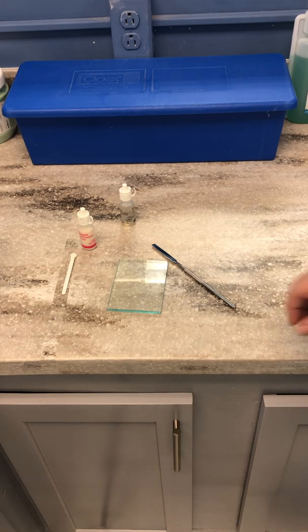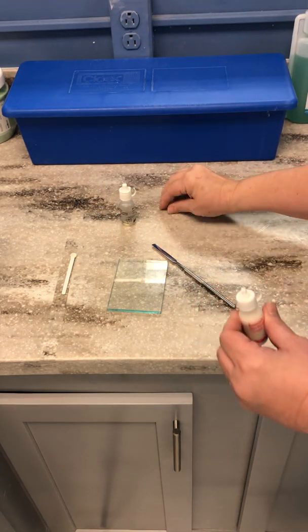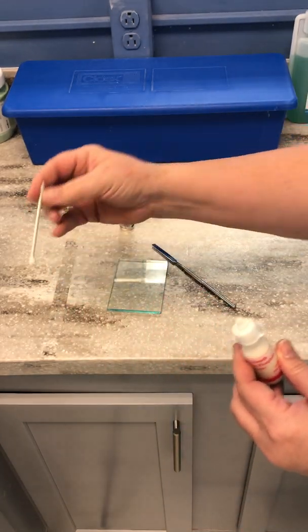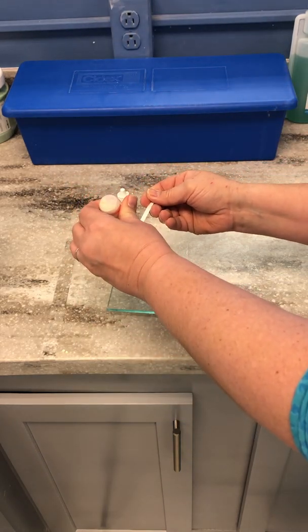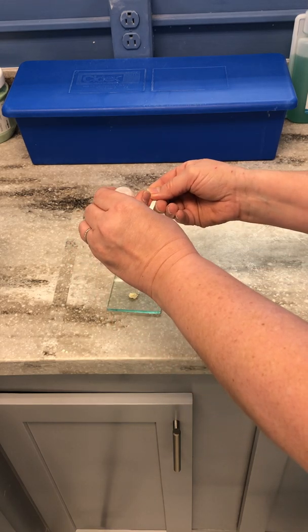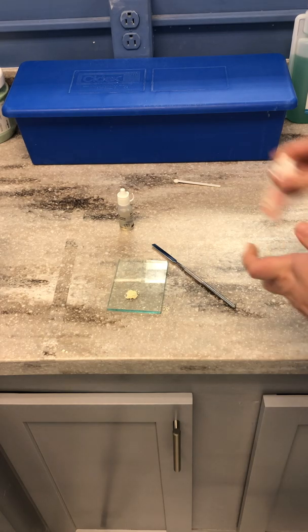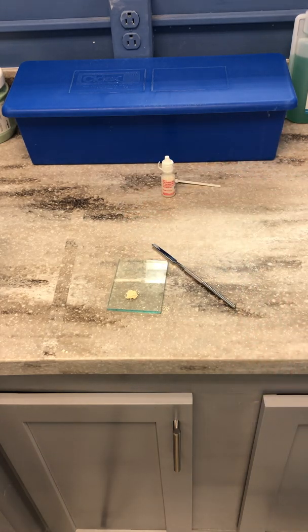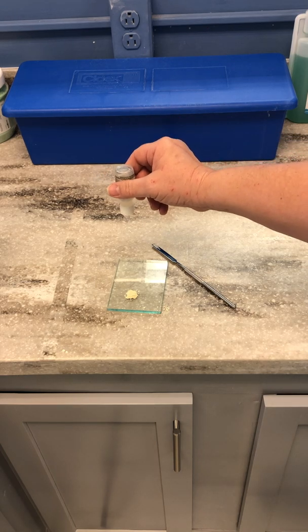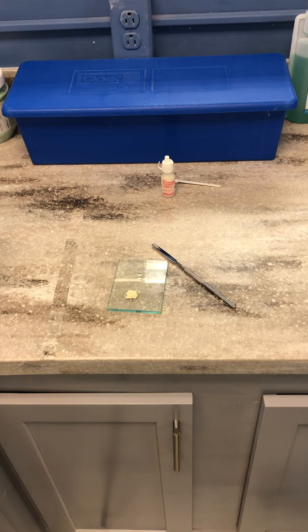We are going to be mixing zinc phosphate cement — this is a base and a catalyst. We're going to take our measuring spoon and do one scoop, two scoops. For the liquid part, you need to make sure you hold it completely vertical and do one, two drops. So this is a one-to-one ratio.